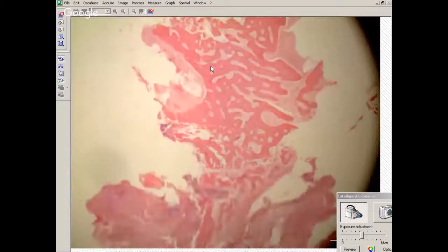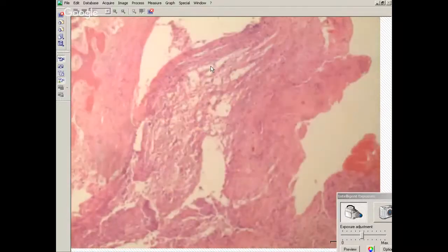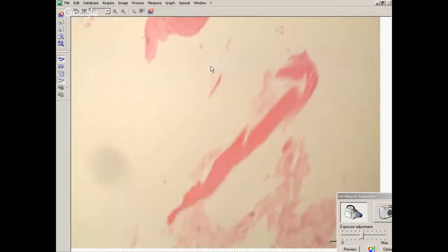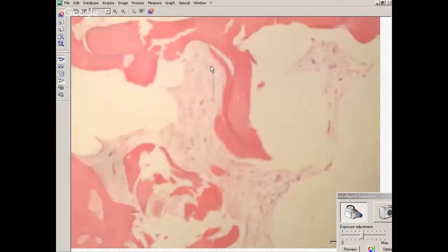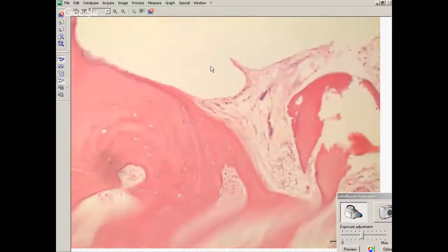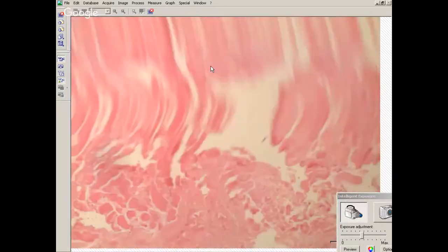So this one was a resection from the nose in a patient that had ketoacidosis, diabetic, really doing poorly. There was a lot of inflammation, granulation tissue. We got bony spicules, and away from the main tumor mass, we had, again, some bone and some fibrous bone marrow, no bone marrow elements. It's just kind of fibrous bone marrow spaces, a little bit of skeletal muscle that's kind of necrotic.